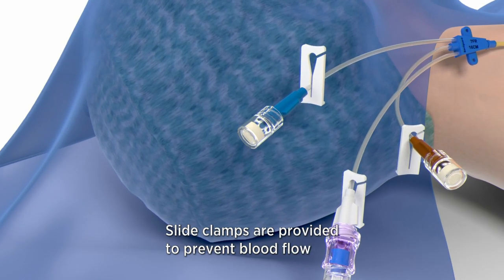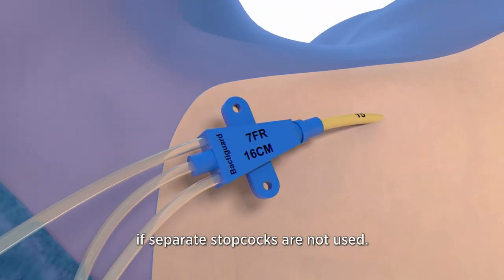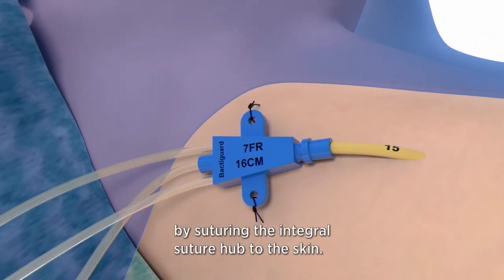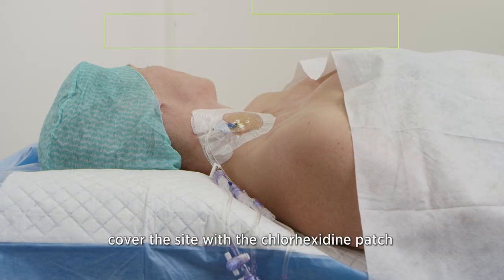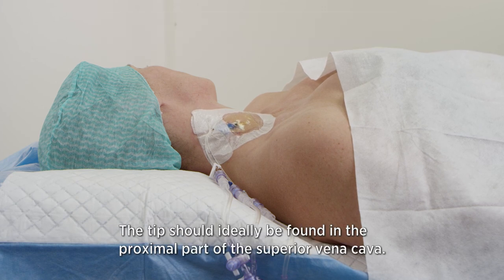Slide clamps are provided to prevent blood flow through each lumen if separate stopcocks are not used. Secure the catheter position by suturing the integral suture hub to the skin. In case you use a longer catheter, clamp a suture wing and a clamp fastener over the catheter to ensure another two suture points. After the procedure, cover the site with a chlorhexidine patch to minimize the risk of infection. Consider a chest x-ray for confirming catheter tip position; the tip should ideally be found in the proximal part of the superior vena cava.